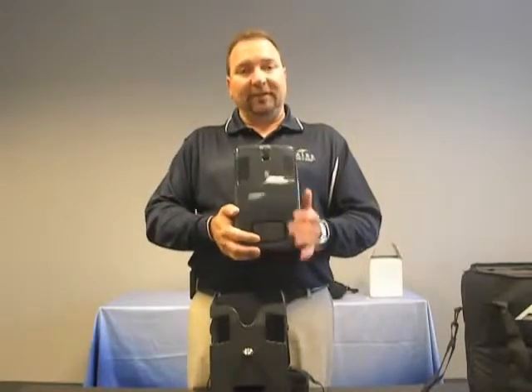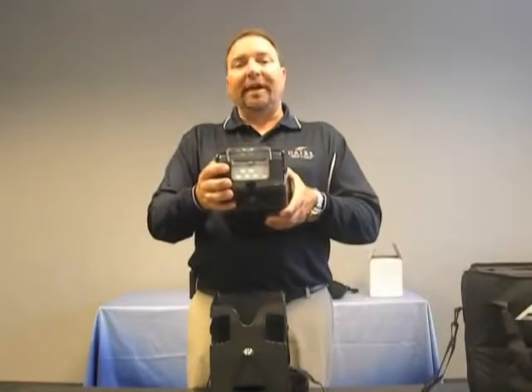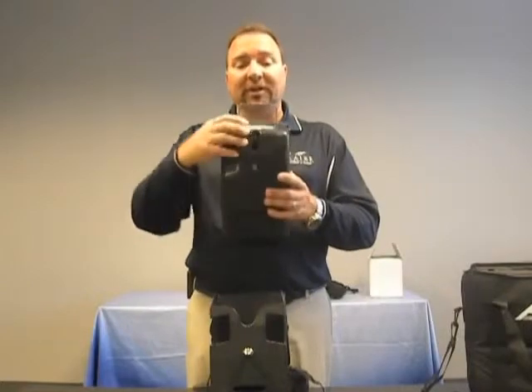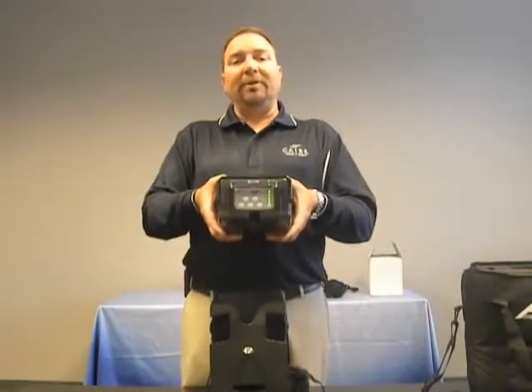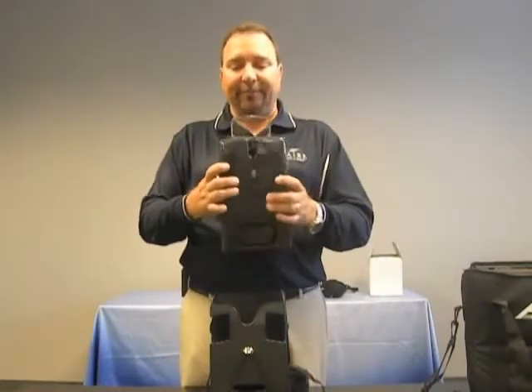At the top of the FreeStyle 5, you're going to see the control panel, which allows the patient to select the flow setting that has been prescribed to them by their physician. In addition, there is a battery indicator letting the patient know how much battery time or the condition of the battery charge of the internal battery.